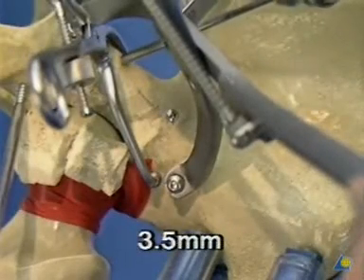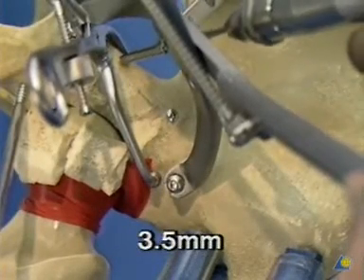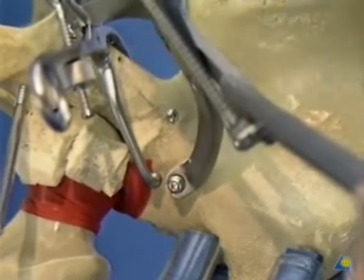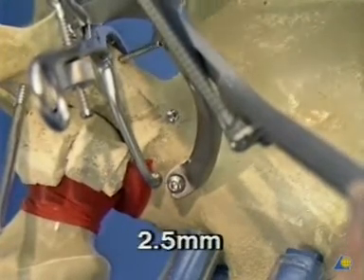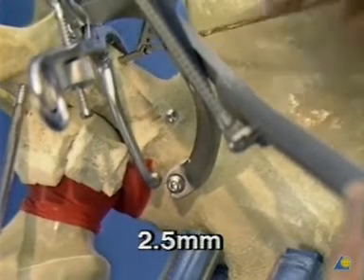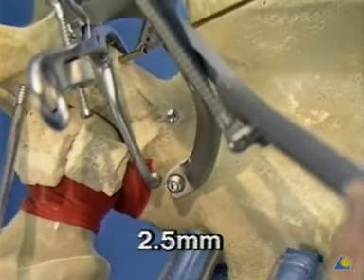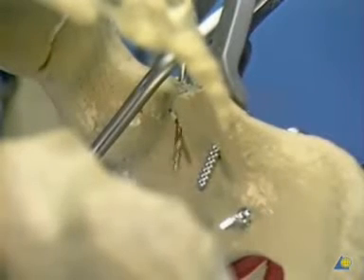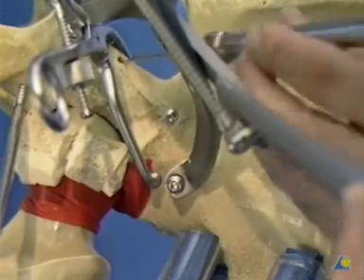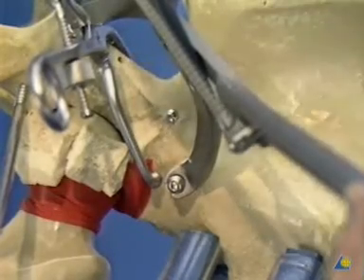A second 3.5 millimeter cortical lag screw is inserted near the border of the greater sciatic notch and just above the transverse fracture site. The 2.5 millimeter drill bit exits the bone on the quadrilateral surface of the ischiopubic segment. After length measurement, the lag screw is inserted.